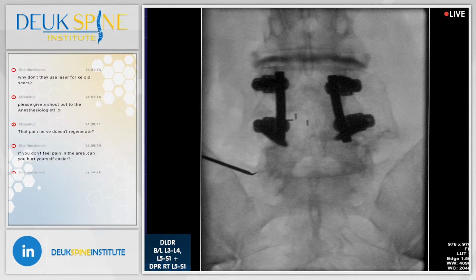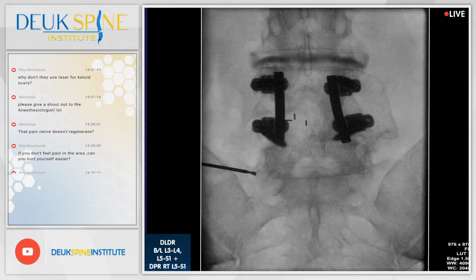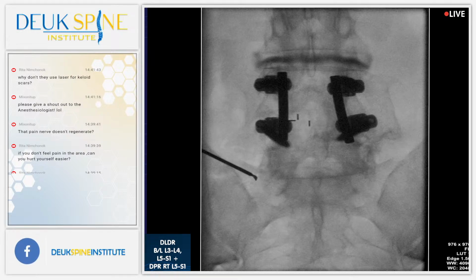Shot. Sorry, it's taken me a minute, but I want to make sure we get this right for this patient. I don't want them having to come back. Shot. All right. That's as good as I can get it.